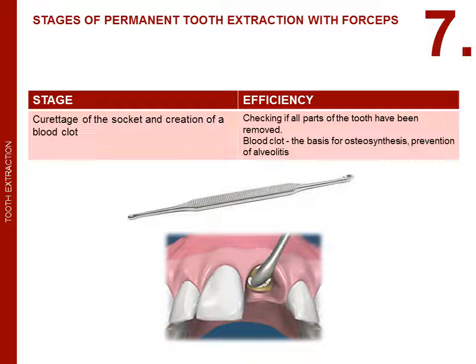Curettage of the socket and creation of a blood clot. Checking if all parts of the tooth have been removed. The blood clot is the basis for osteosynthesis and prevention of alveolitis.